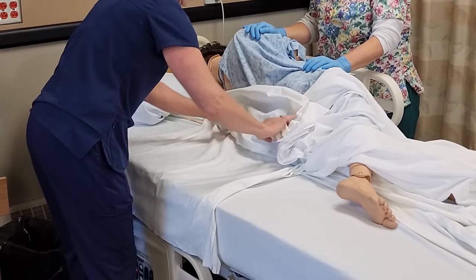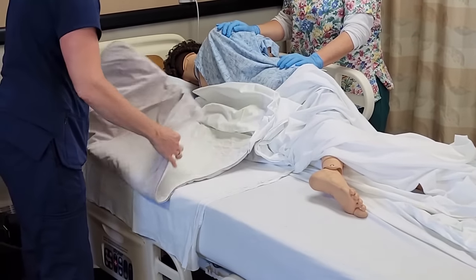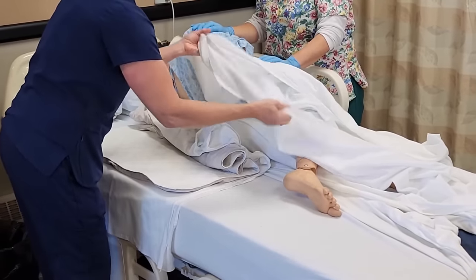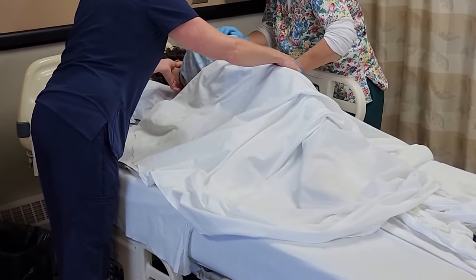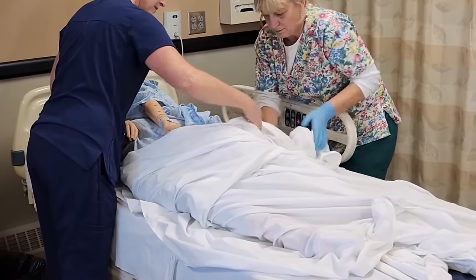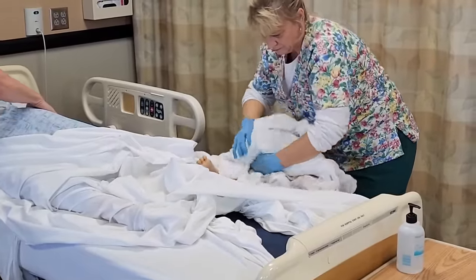I'm going to fan fold that down and I'll do the same with the soaker pad, again using the fold in the middle. Okay Annie, we're going to have you roll back over — there's going to be a big bump underneath you. We're going to use the lift sheet on that side: one, two, three. Then Kim's going to get all the dirty stuff out and throw that in the linen bag.